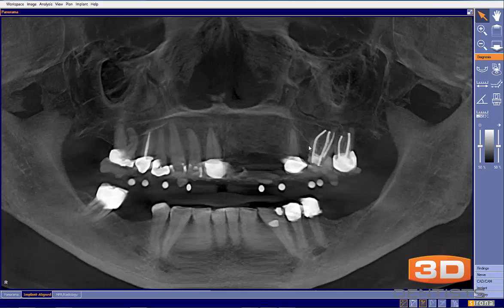In looking at that, we're treating the upper arch, and the vast majority of the teeth here, I mean everything except maybe one or two, have full coverage restorations on them. The only ones that may or may not have full coverage restorations are right here, and they look like they have ceramic restorations. This would be a great case to use the classic guide, or what I call the analog workflow. The analog workflow starts with taking a bite plate relined, and that can become your surgical guide.